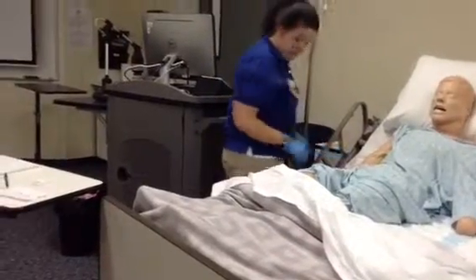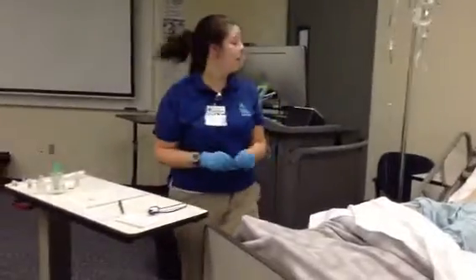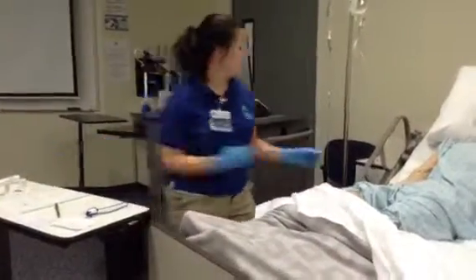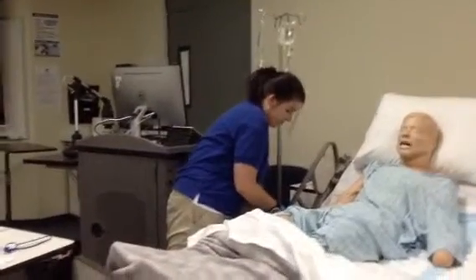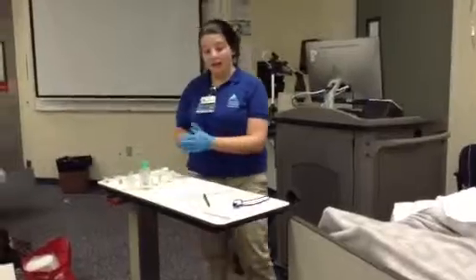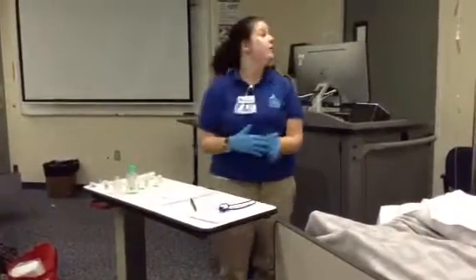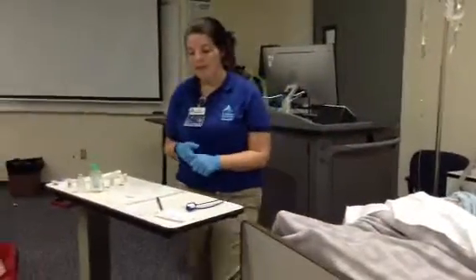Alright, and I don't see any inflammation or anything. The site's looking wonderful today, okay? And I'm going to go ahead, just to be safe, and clean the spot where you had the piggyback, so you don't have the risk for infection or anything like that, okay? Just want to keep it clean. Okay, at this point in time, my vancomycin is running at 17 drops per minute, okay?